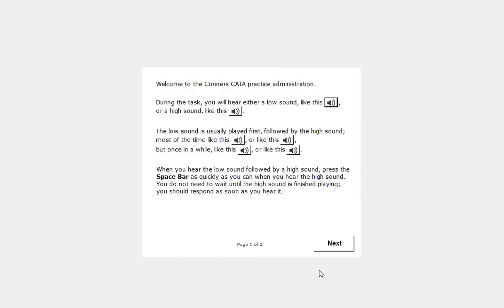Just like the Connors CPT-3, observe the respondent carefully since the administrator is responsible for deciding whether the respondent is ready for the actual administration. Now, let's begin the practice test, which runs for approximately one minute, beginning with the practice administration instructions.